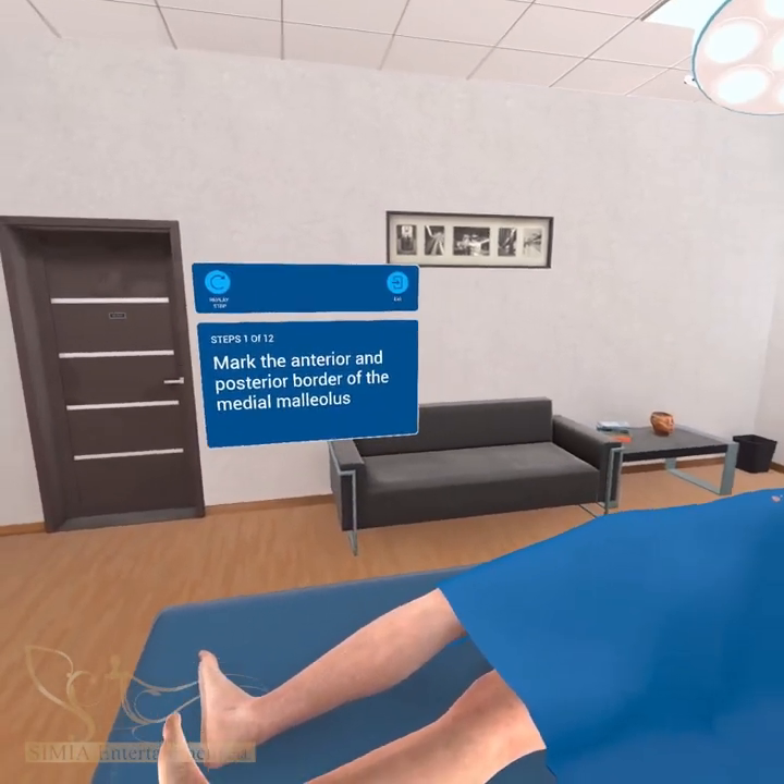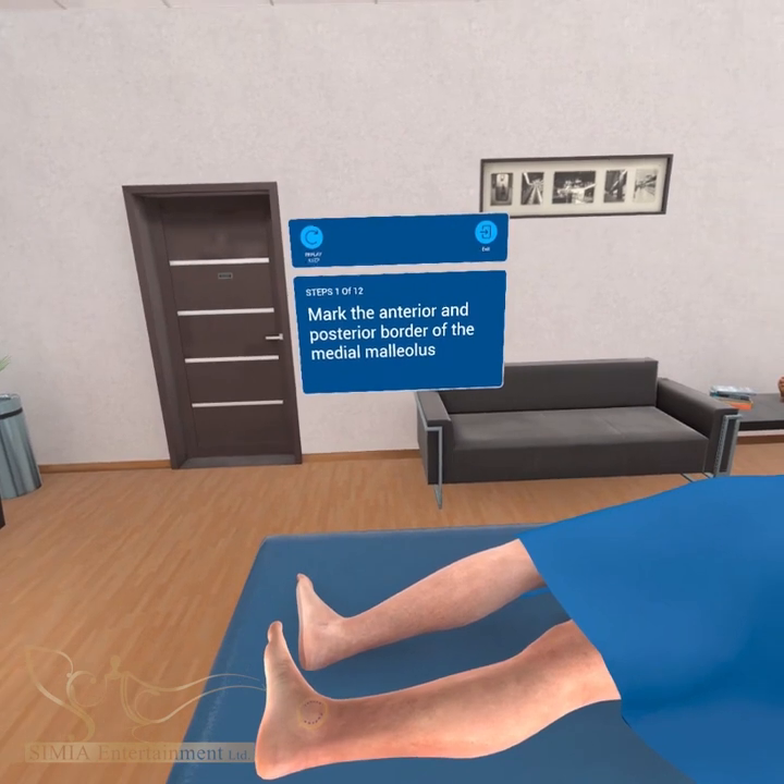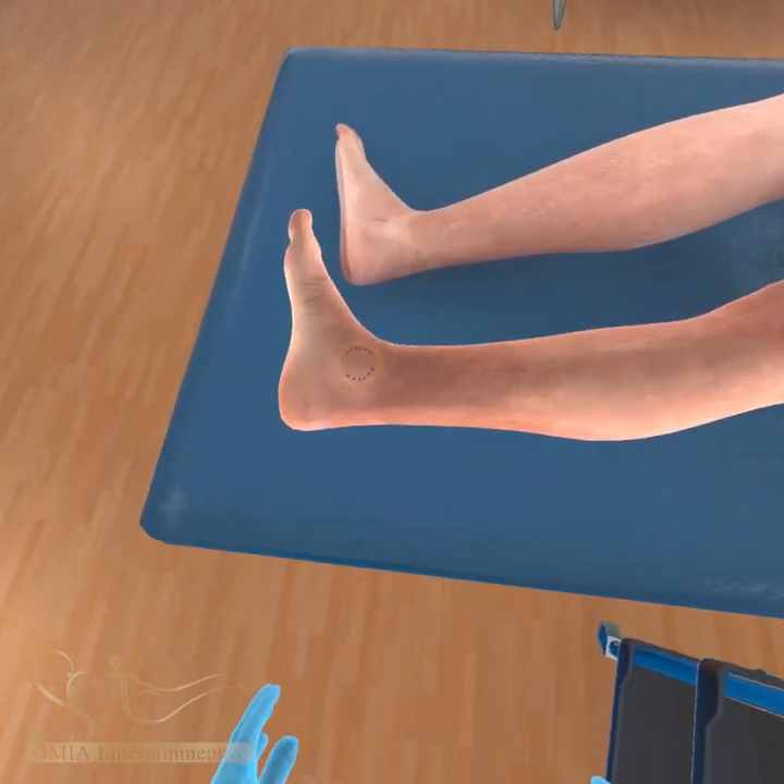First, mark the anterior and posterior borders of the medial malleolus using the marking pen.